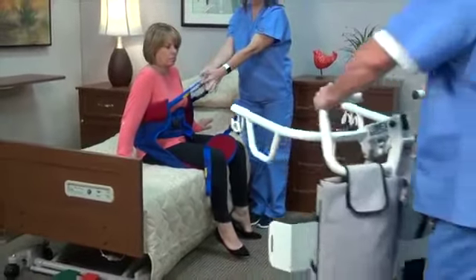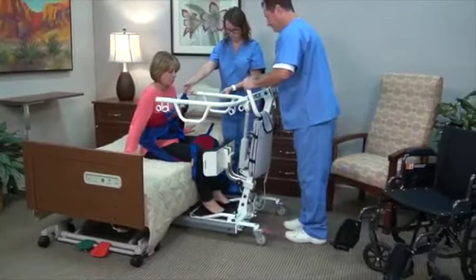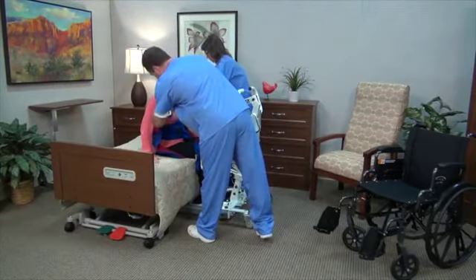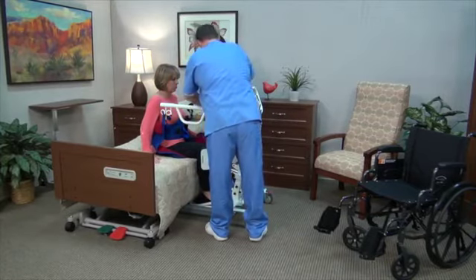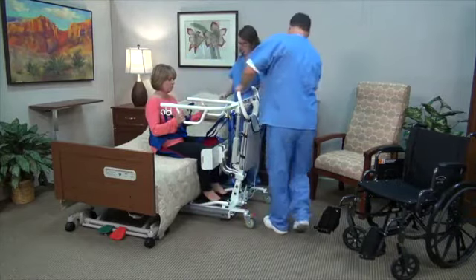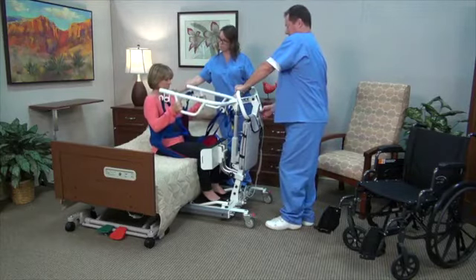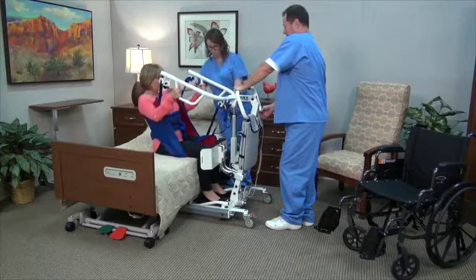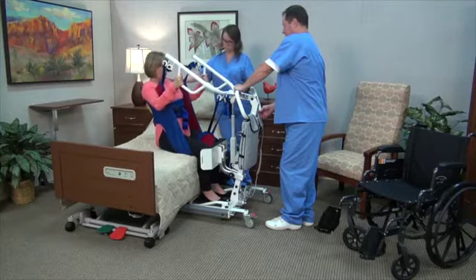Push the lift towards the resident and open the base of the lift. The sit-to-stand lift can be used with the casters either locked or unlocked. Position the resident's feet on the foot platform and knees against the knee pad. Attach the sling straps to the hooks on the lift. For a taller resident, use the hook closest to the outer edge. Residents should hold the hand rails and lean back slightly. For residents who cannot hold the handles, have them hold their arms across their chest. Press the up button until the resident's body has completely left the bed.